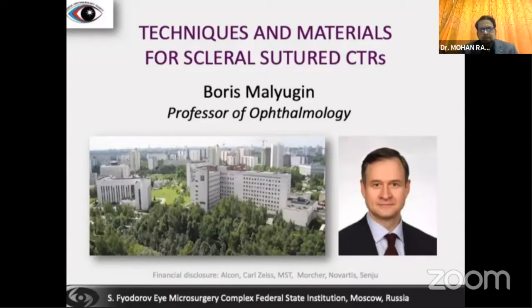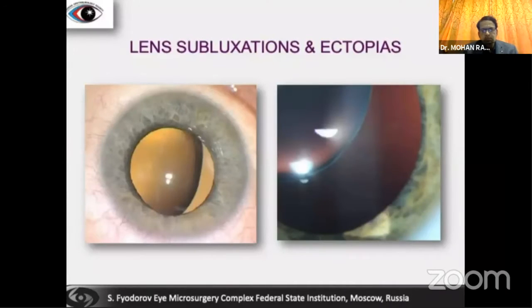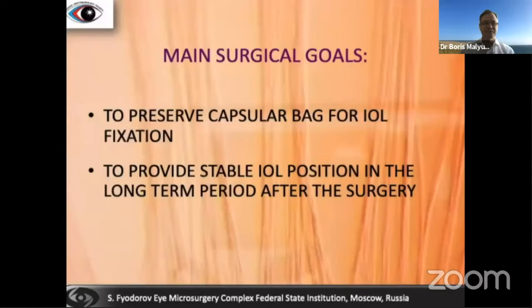It's my great pleasure to discuss with you today different techniques that are used for patients with lens subluxations and ectopias. The main surgical goals in these patients are to preserve the capsular bag for IOL fixation and to provide stable IOL position in the long term postoperatively.